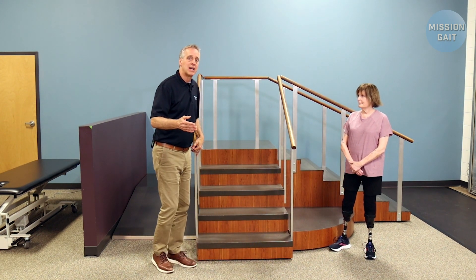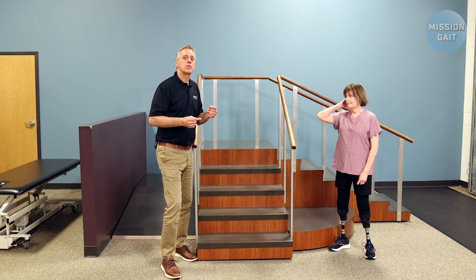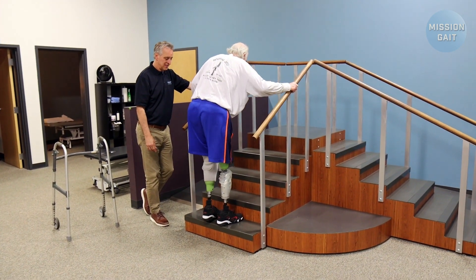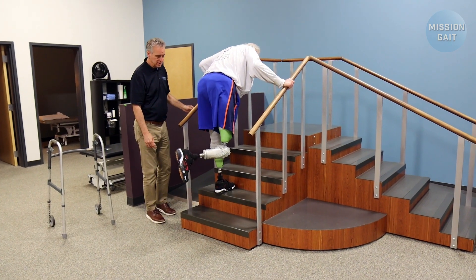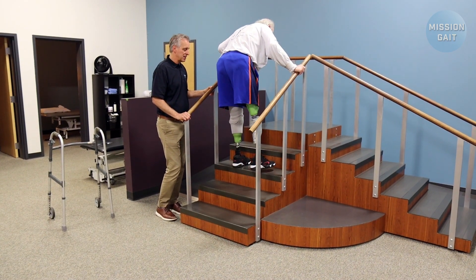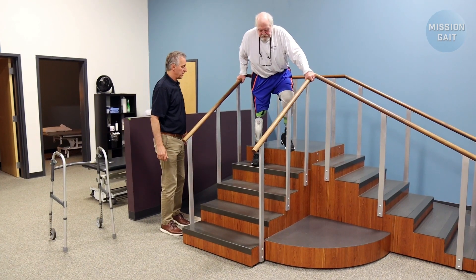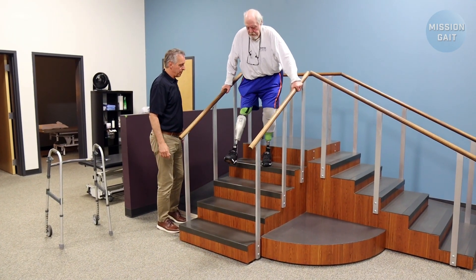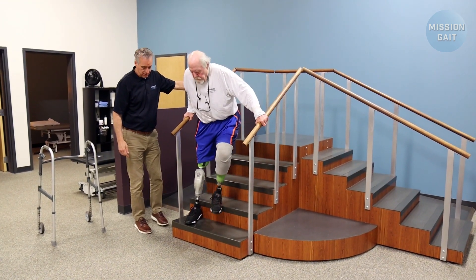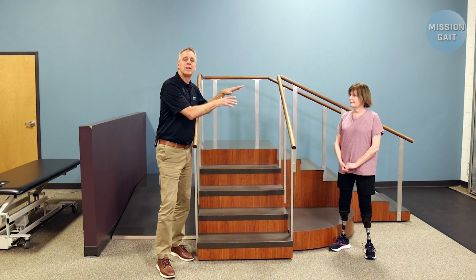The next thing we're talking about is the above-the-knee and below-the-knee combination. In this situation, you want to step up with the below-the-knee first — it's a more natural motion — doing one step at a time, bringing the above-knee up as well. You have to give that little bit of an exaggerated backwards motion to clear the toe when you go over the step. Coming down, you do the opposite: step with the above-knee prosthetic down first, then bring the below-knee down to it, one step at a time. Same thing — both rails — and you can assess it with a single rail as well.